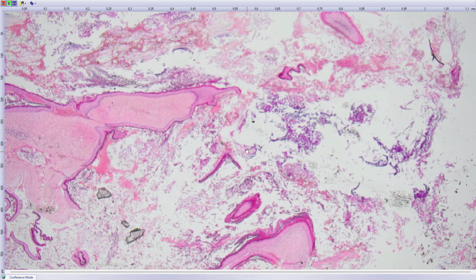Epidermoid cyst? What? Epidermoid cyst? Yeah, and it is an epidermoid cyst, and what does it mean with the previous lesion?